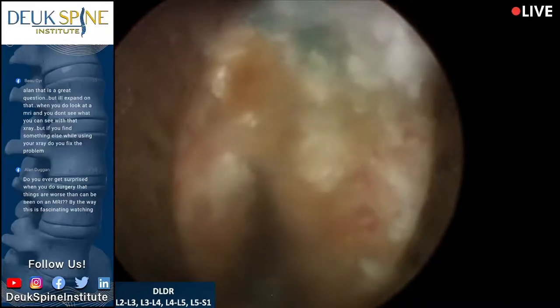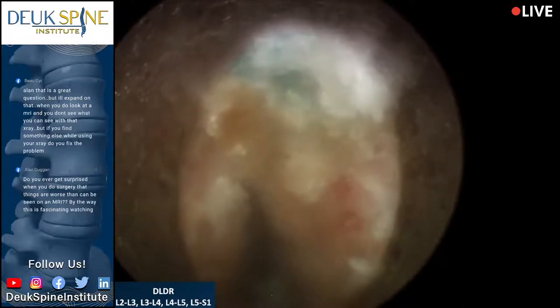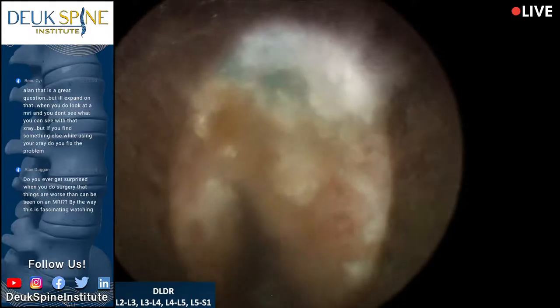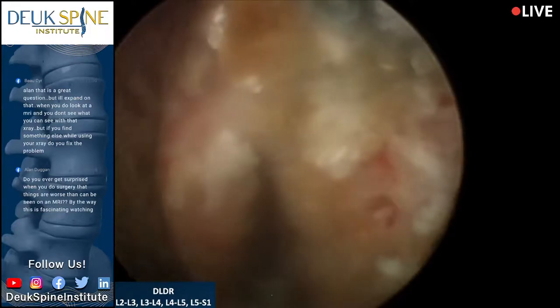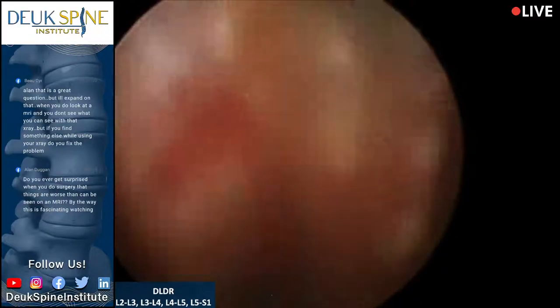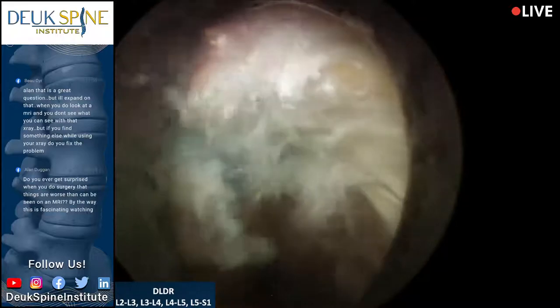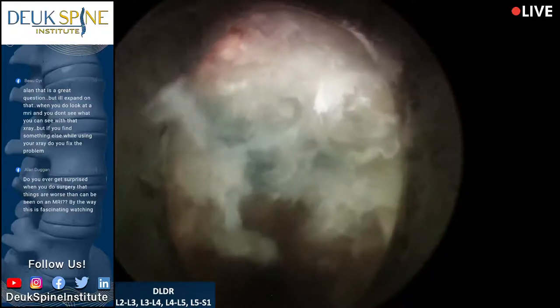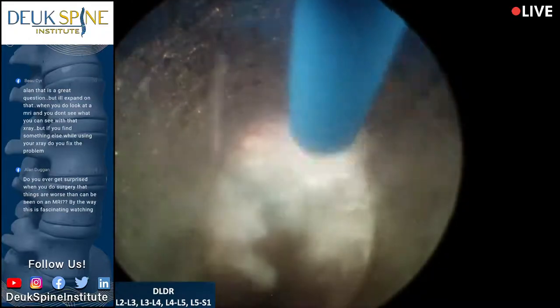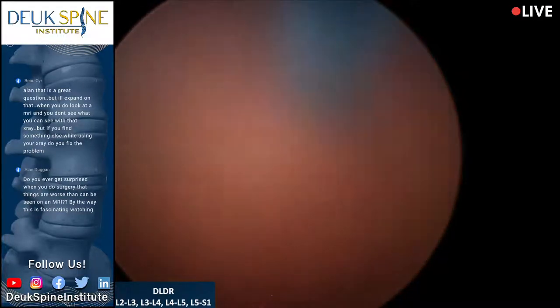All right, what are we looking at here, folks? We are inside the annular tear on the left side of this patient's L4-5 disc. And you can see that what's bleeding there is the end plate, basically a bone spur that I had to remove. And this is really the end of the annular tear right here. So we're going to clean this up. There's some more inflammatory tissue, the pink stuff. You always know inflammatory tissue because it's pink. It's pink because of all the blood vessels that are in it.